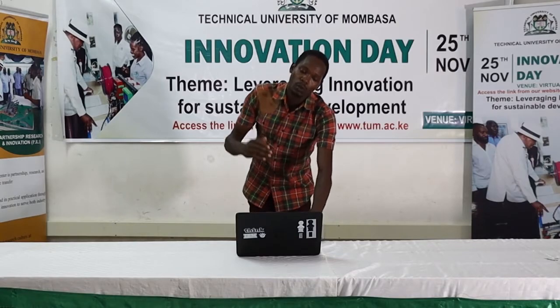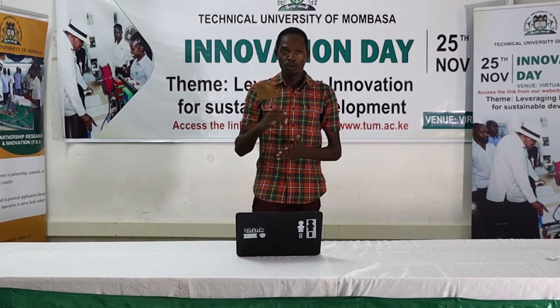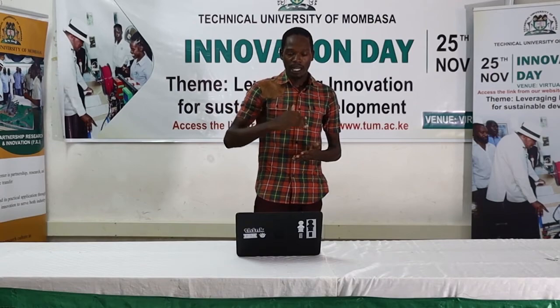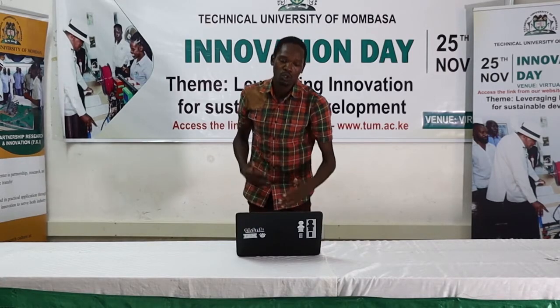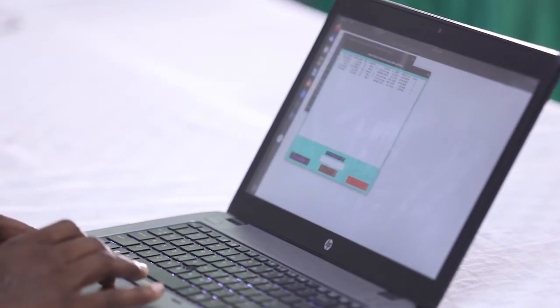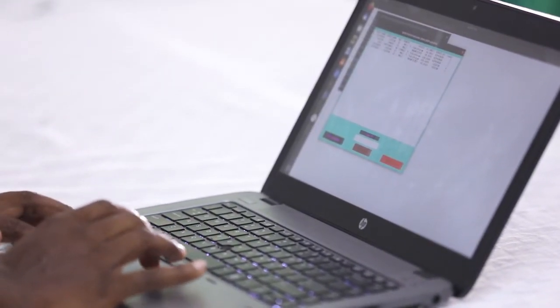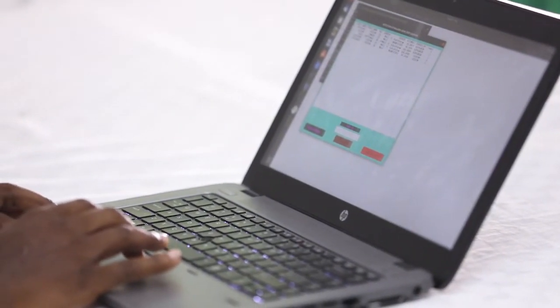In case you now want to see the results, because you'll be performing a set of diagnoses, and you want to see which image had malaria and which one did not, you just have to query the database, because everything is saved to the database. You just click a button, and it will show you all the diagnoses that you made. Since we made 2 diagnoses, the first one is Plasmodium falciparum, that is 100% accuracy. The second one is 97%, but it is uninfected.